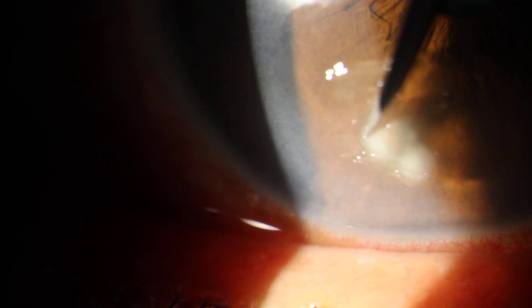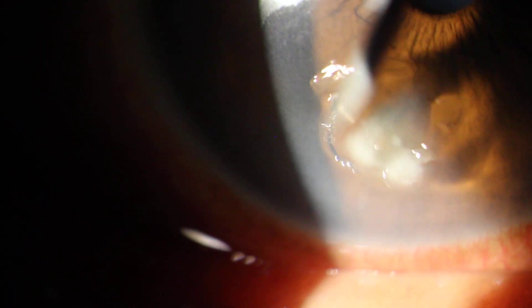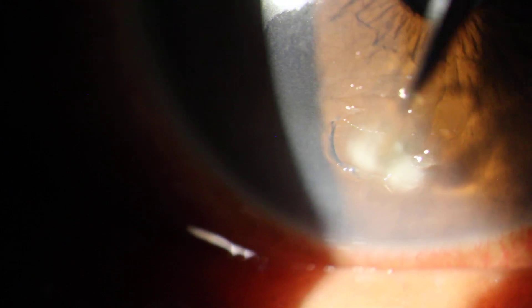Good. Should be it. Okay. Trying to get this last piece off. There we go. That looks good. Good.